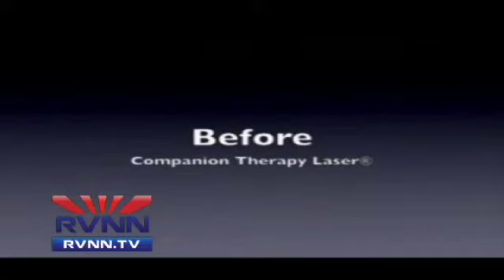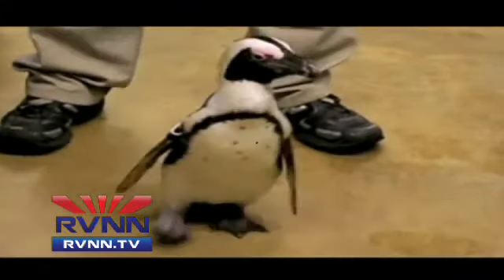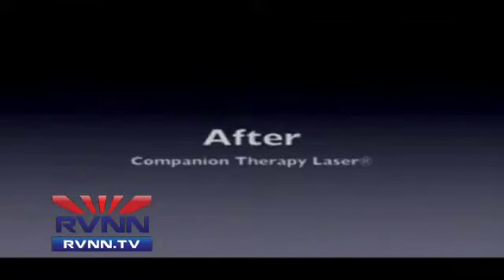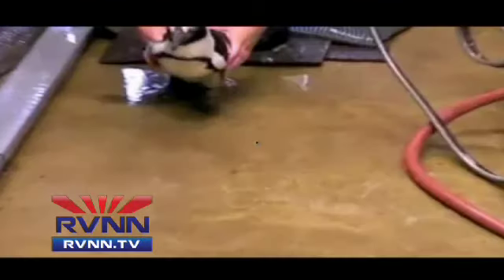We've actually got a little clip of a different type of professional athlete, where you can see the effect that a laser can have. Owners ask, okay, so you shine this invisible laser on my dog, and you can't feel anything and you can't see anything, how does it work and is it going to work? It's important to know that it takes several treatments. So this little guy here is a little penguin who has a very sore leg, and it works on any species. This is after about 9 treatments with the laser for him.